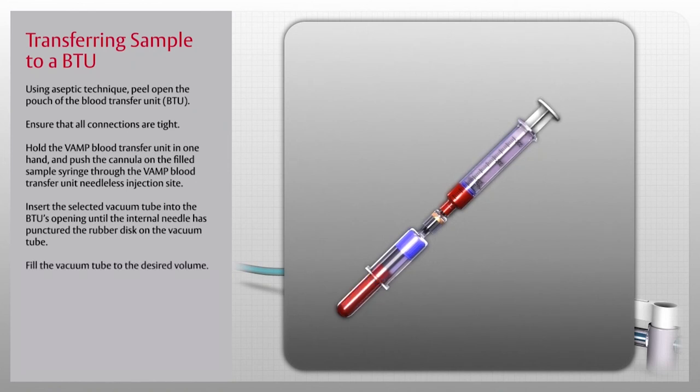Fill the vacuum tube to the desired volume. Repeat filling tubes according to the requirements for the patient's blood study.